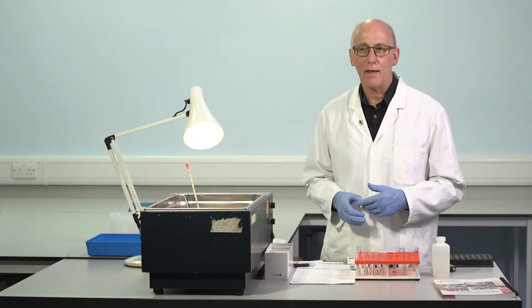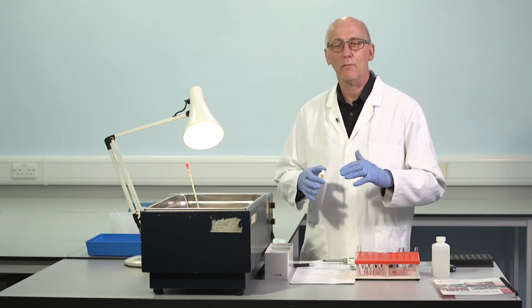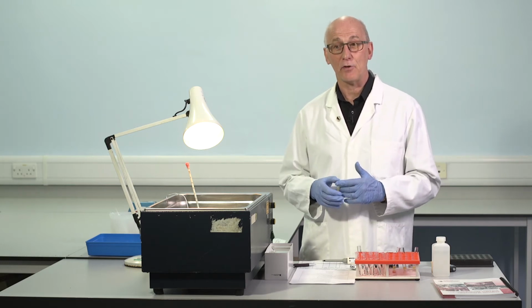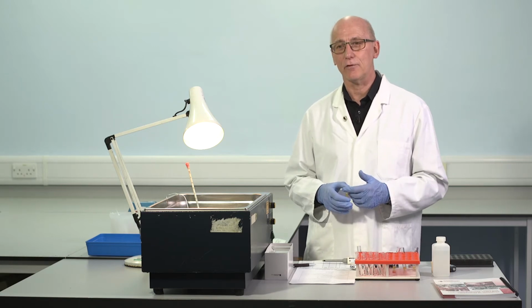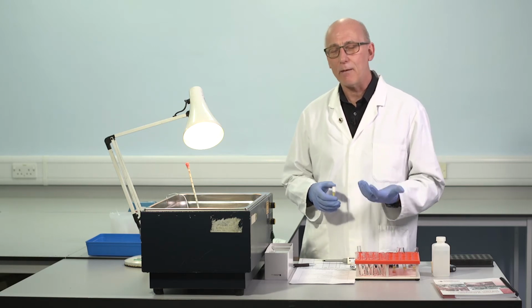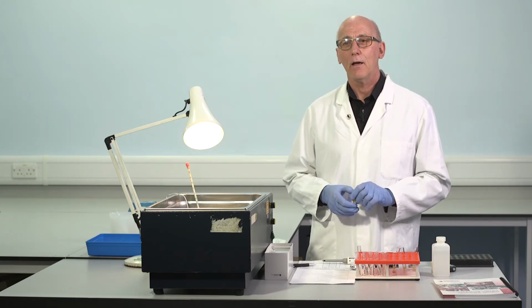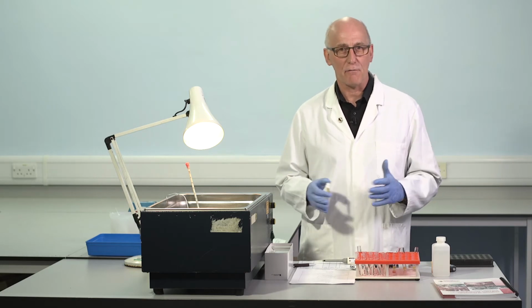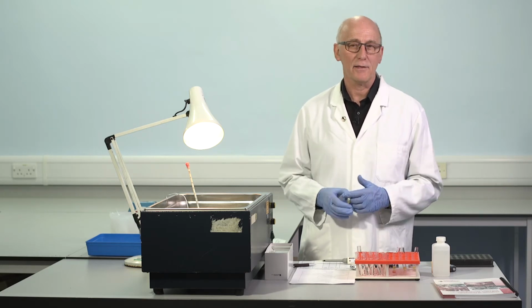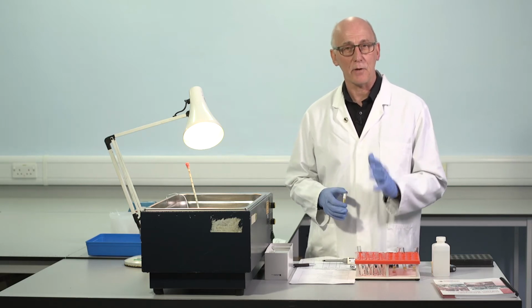Tempting to use these in the lab, much cheaper than laboratory grade freezers, but they very frequently don't maintain the temperature even at -20. There may be, for example, auto defrost cycles that raises the temperature. You can get partial thawing of samples. That can introduce important differences. So we really need to be sure the samples are stored at a low enough temperature, -35, -50, -70, -80, even liquid nitrogen, -200. All of that, they're all fine, but not -20.